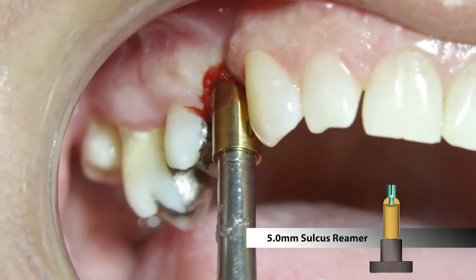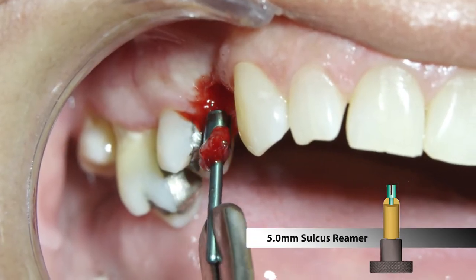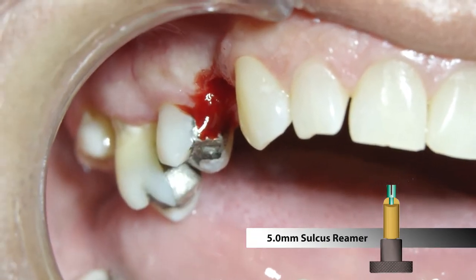The reamer is rotated 360 degrees while applying apical pressure. Upon removal of the green guide pin, the excess tissue is also eliminated.